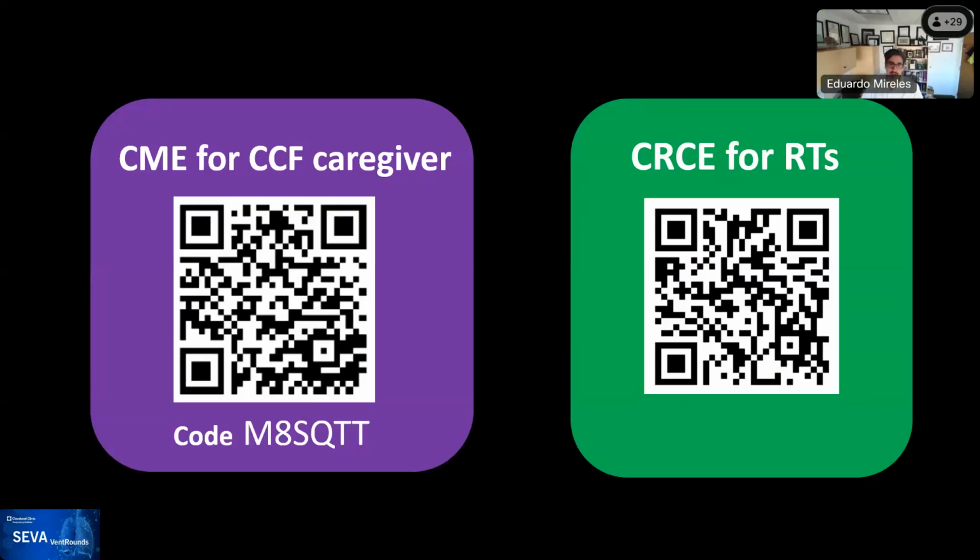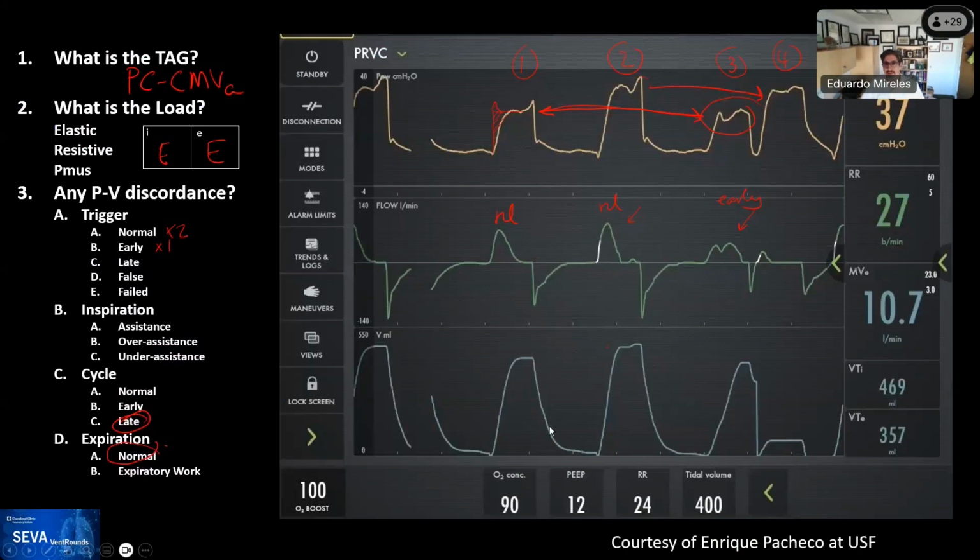So good job, everybody. This was an interesting case. The only thing that I would say, dealing with this patient in particular, would be, again, the goal, and then probably decrease the rate on the patient. It seems that it's doing both at the same time.